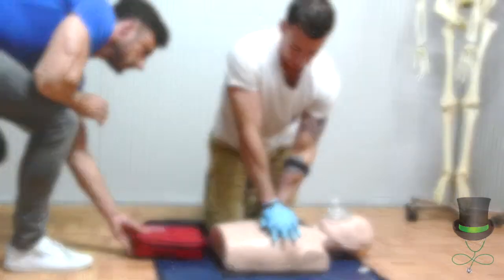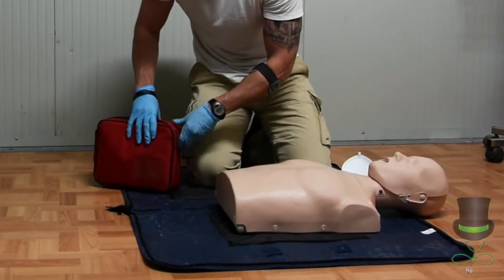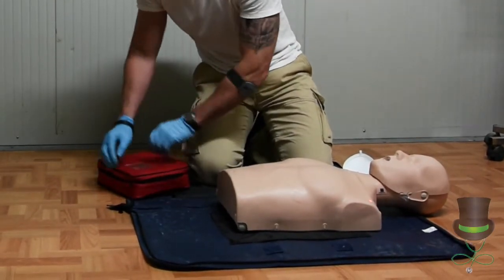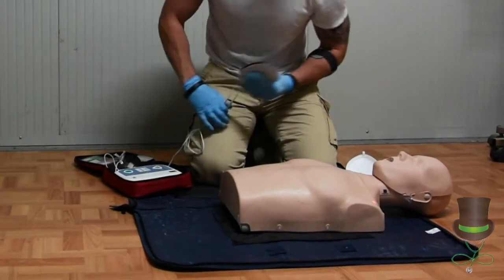Hands on the way, there's the AED. As soon as your AED comes, turn on your AED. If there's another bystander present, they can continue to carry out compressions.